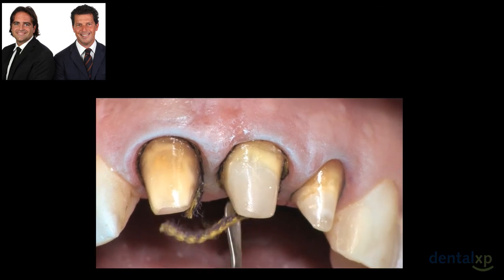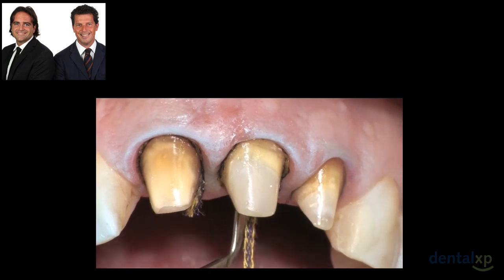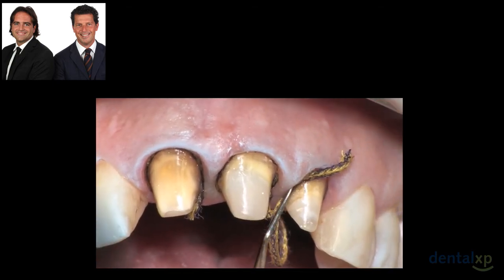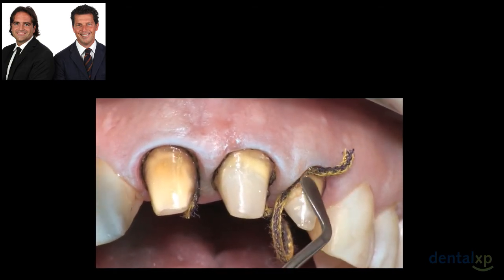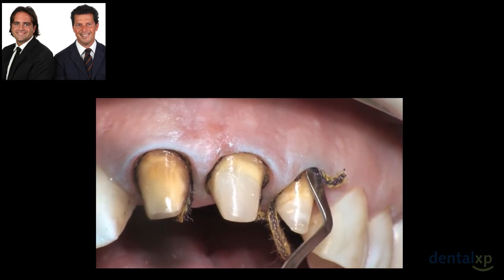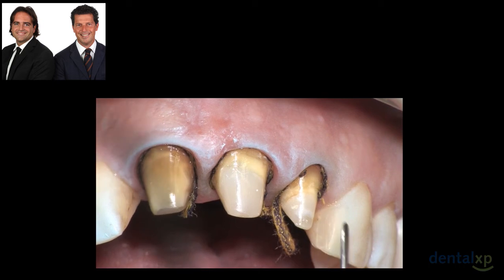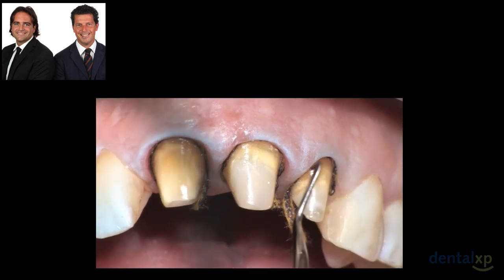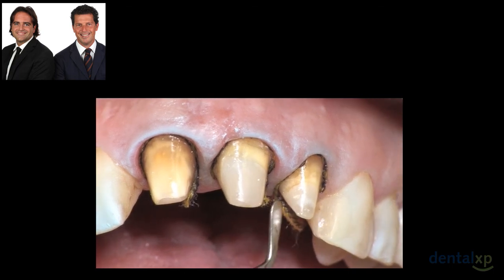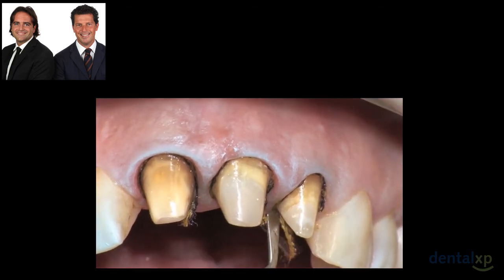And you can see here we are packing the second cord, and you're gonna see that we are gonna leave these cords in place while we scan also the opposing dentition, because we want to leave this cord as much as we can in order to give them time to do what their goals are. You see, very carefully packed all the three cords.